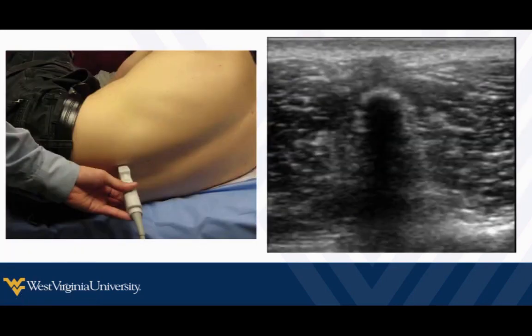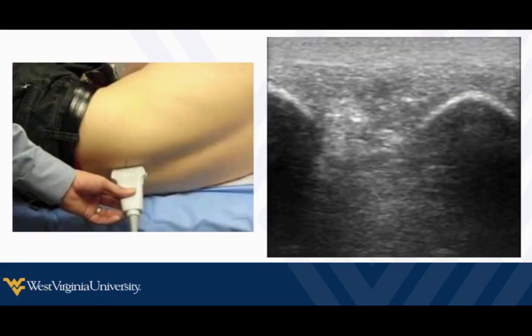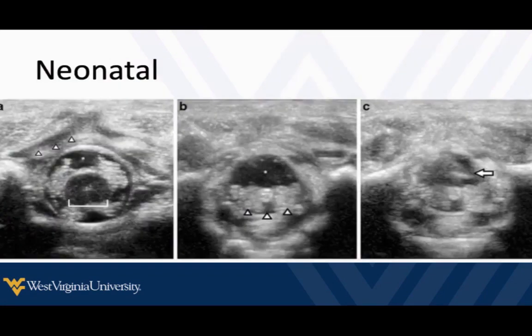In larger patients, we may need to use a curvilinear probe. This is a pediatric patient — the body positioning isn't ideal, but the spinous process is going to look like that. Then we can get our longitudinal views. If we're doing neonates, we can pretty much see through their spine because it's going to be mostly cartilage. We can tell if we're too high up because we'll actually see the spinal cord, so we want to slide down more distally to where we're at the cauda equina and have a nice spinal fluid pocket.